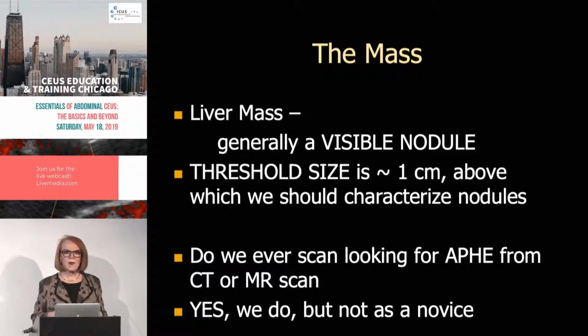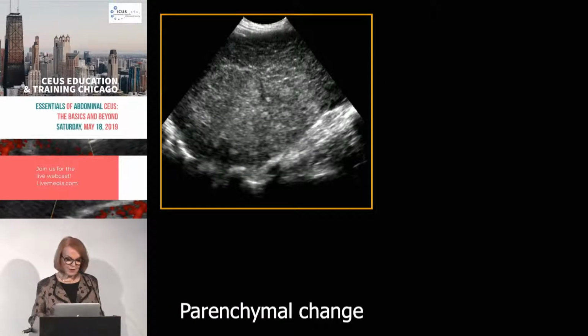However, this is something that you're not going to do the first month or 2 months or 3 months that you're out there. You want to have a good lot of experience before you try shooting to find a mass that you don't see. So valuable, but not for the beginner.